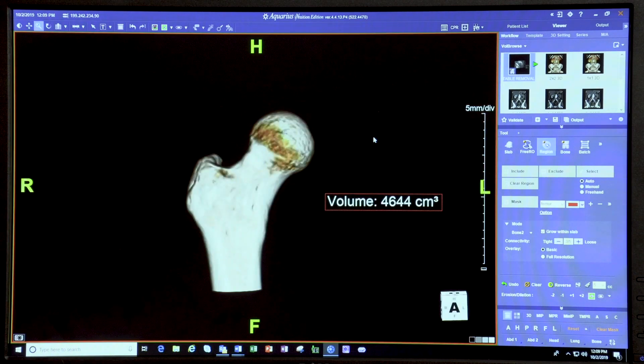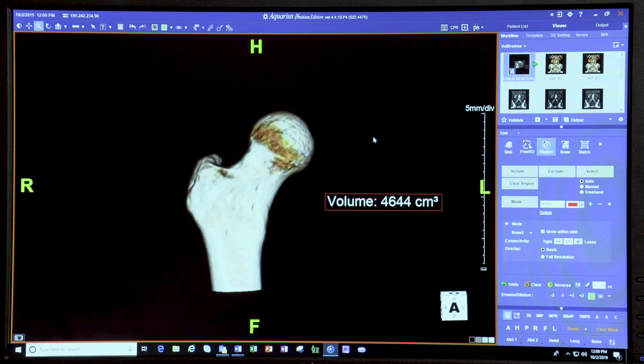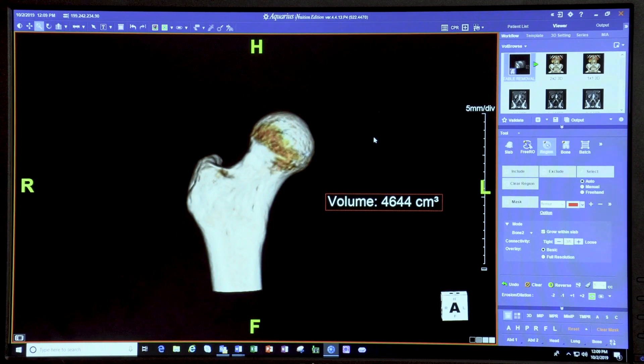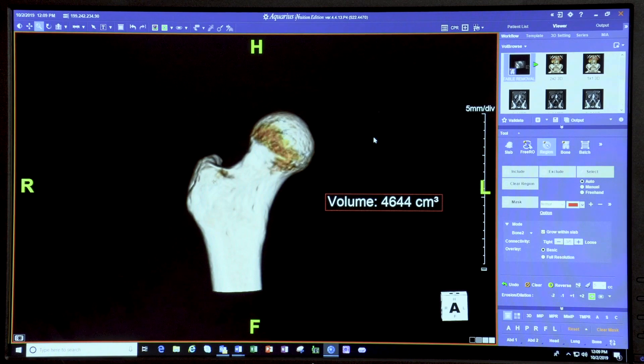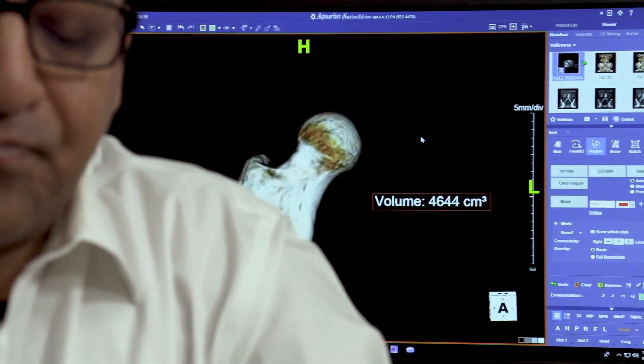That concludes our section on whole pelvis segmentation and femoral segmentations. Next, we'll look at how to do different measurements — looking at the pelvis from a top-down view to assess whether the femur is undercovered or overcovered. We'll describe measurements like alpha angles and center edge angles and how to enter these into your structured report. Thank you so much for watching.